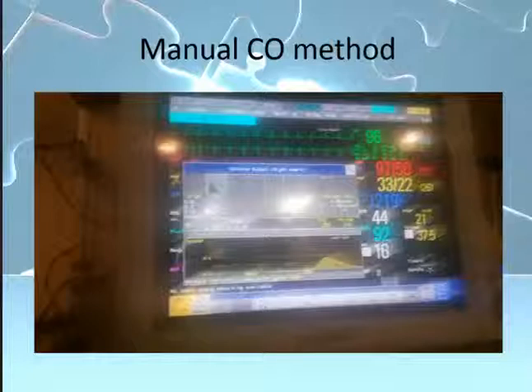You will say you got it first on shift and now you have something to compare it to when you're looking later. Hey, his waveform didn't look like that earlier today, but it does now, and you have something reproducible, something you can show the physician when he comes in.